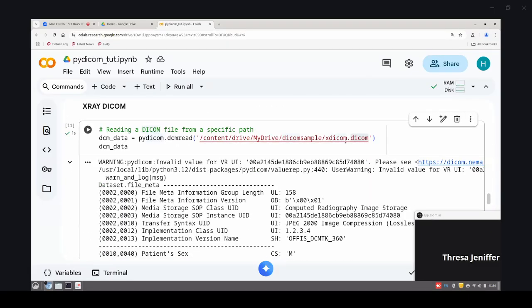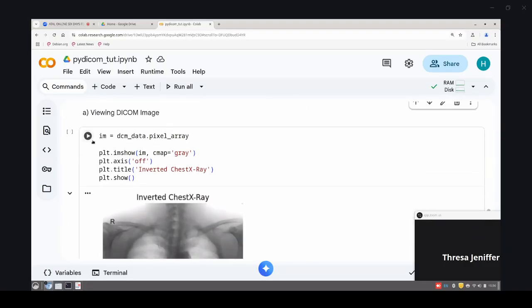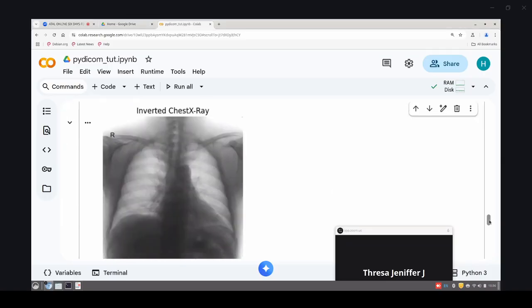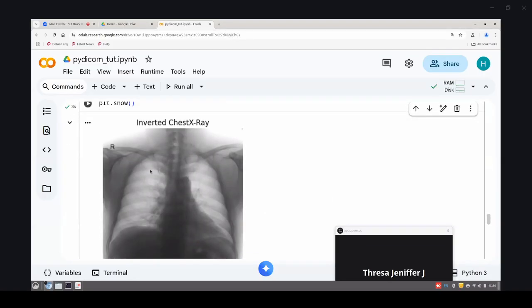And this is actually an X-ray image. So actually, I am seeing an inverted image, an inverted X-ray image here. Inverted X-ray images means all the white pixels in the X-ray images are converted to black, and all the black pixels are converted to white. This is generally used by doctors to identify diseases in case the disease is not properly visible in the input image.